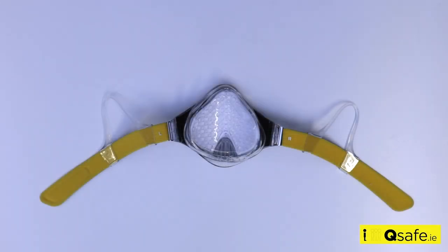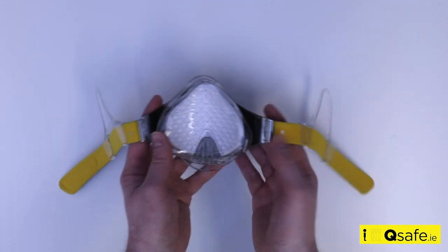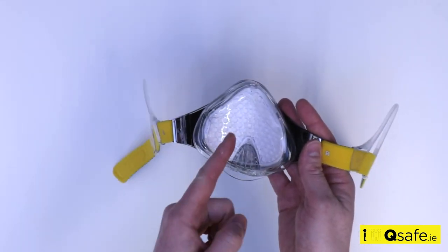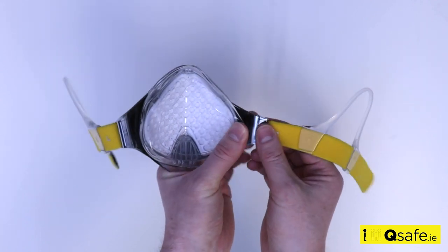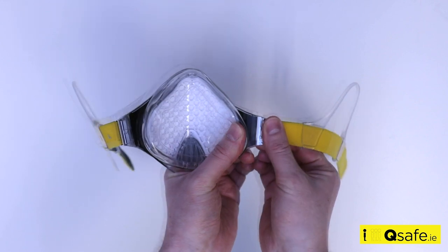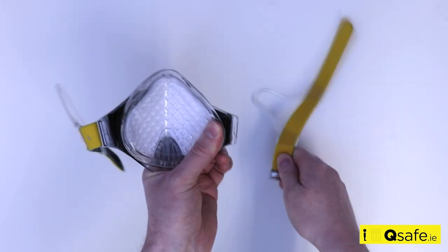When it is time to replace the filter, the face mask should also be sterilised. To begin, you need to take the mask apart. Remove the headband straps and take out the filter housing to remove the old filter. To remove the two headband straps from the face mask, hold the metal hook and face mask firmly and gently pull the headband hook downwards to disconnect.